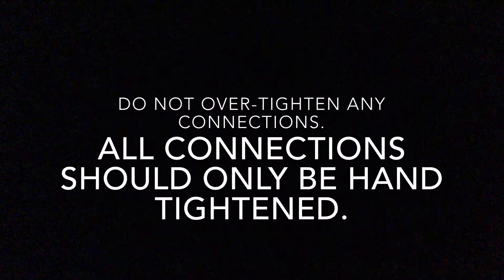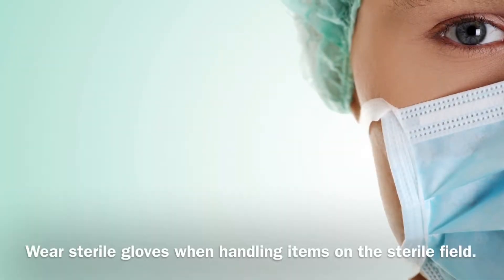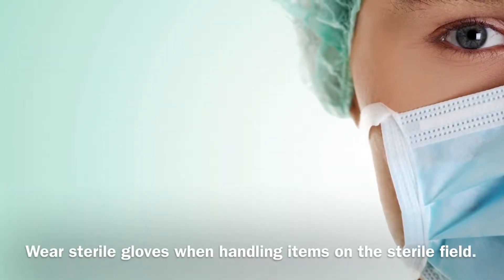Do not over-tighten any connections. All connections should be only hand tightened. Wear sterile gloves when handling items on the sterile field.